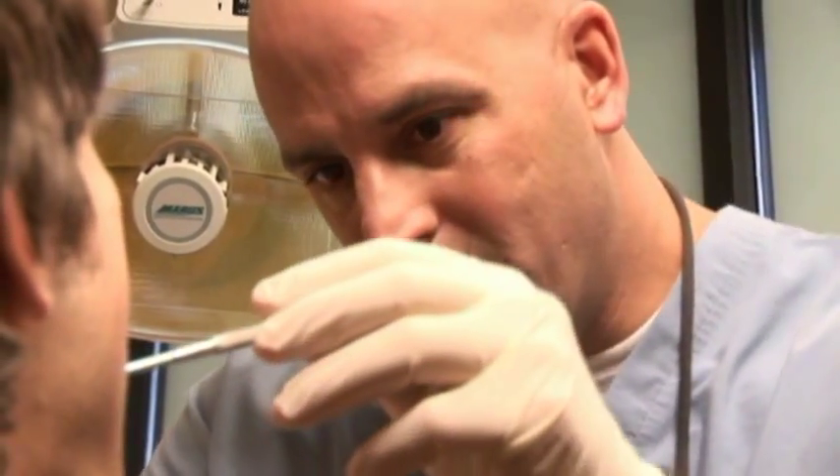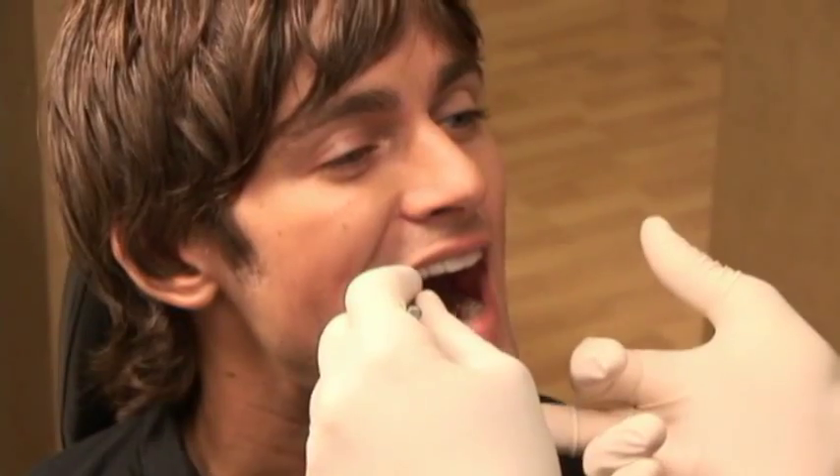For non-Invisalign patients, we approach the subject either in new patient consultations or if we notice lower adult onset crowding and things like that. I chose Vivera retainers because they're very similar to the Invisalign that I had been wearing for the previous year.